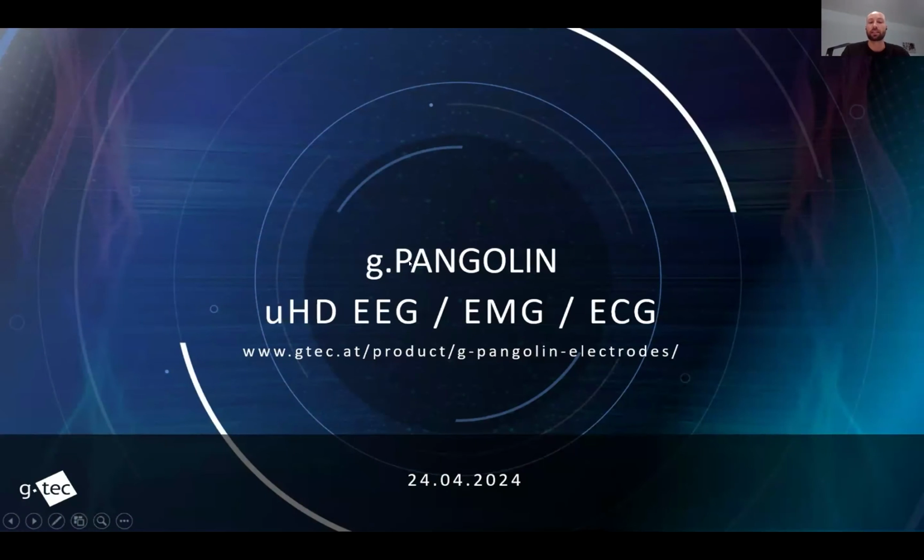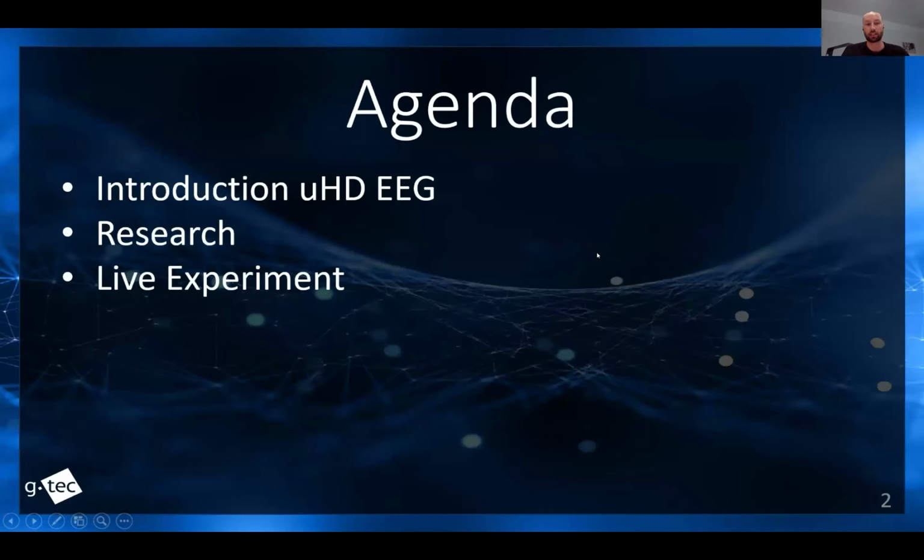Today I'm going to present the g.PANGOLIN system, and Pauline and Matteo are also going to show their work they did at g.tec for the master thesis. I'm going to give you a little introduction about the Pangolin system in general. Afterwards, we'll show you some research outcomes, and in the end, while Matteo and Pauline are presenting, I'm going to prepare a live experiment, and we'll run a live experiment shortly.